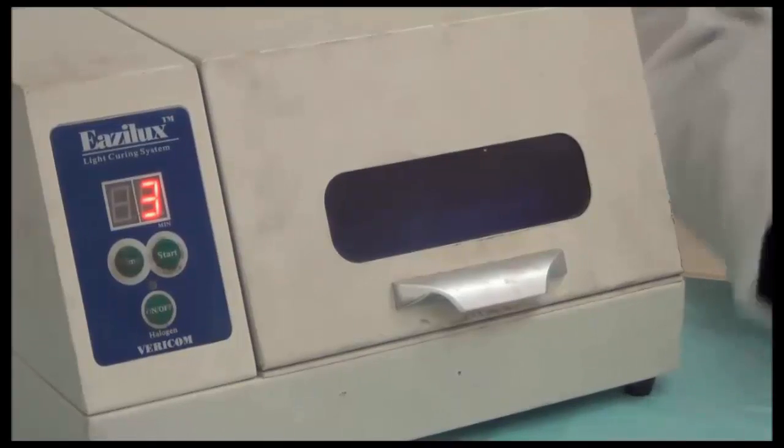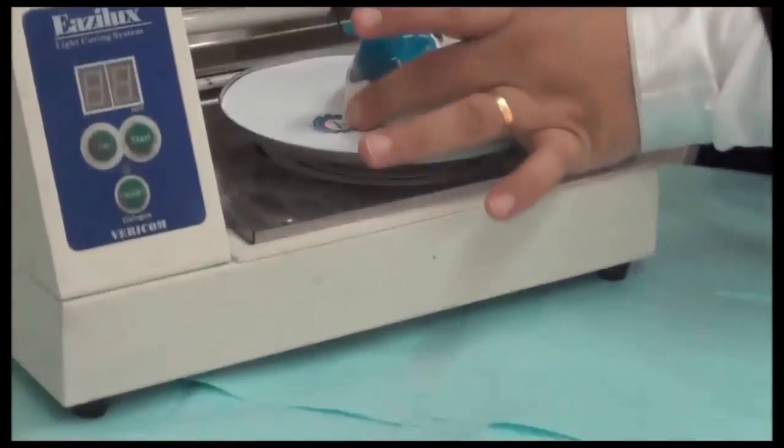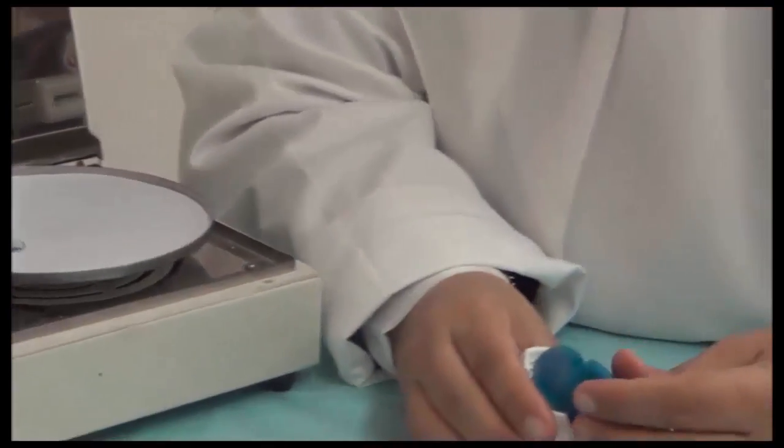Now that the first cure has finished, we're going to remove the tray, separate it from the cast.